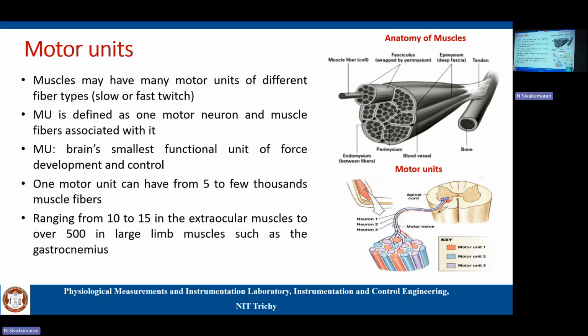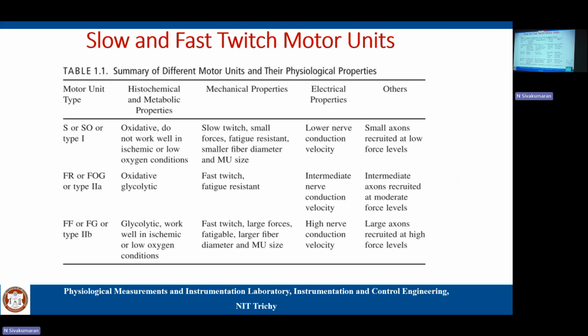So generally in rehabilitation, for example, muscles will be there and will be contracting, but the force may not be the same because of amputations. So what we will do is collect the signals that are generated due to this muscle contraction, and we will use those signals for producing that force, or restoring the movement.